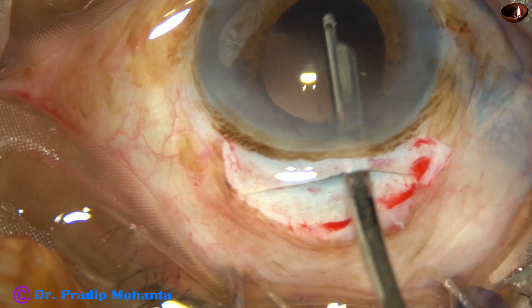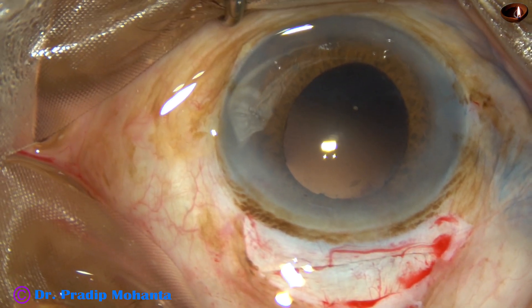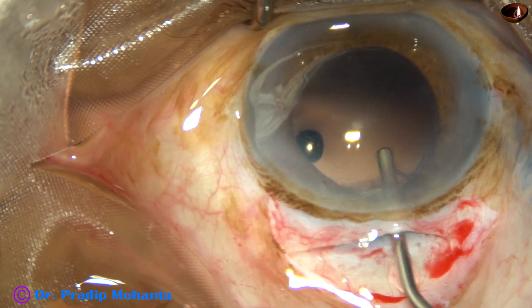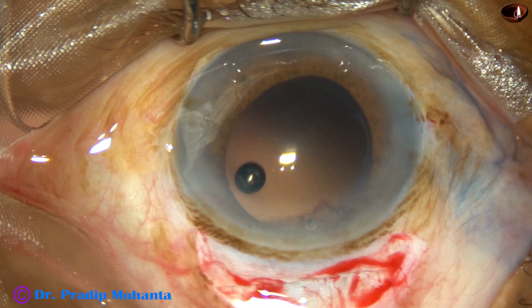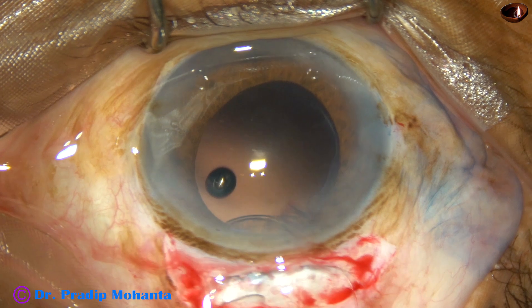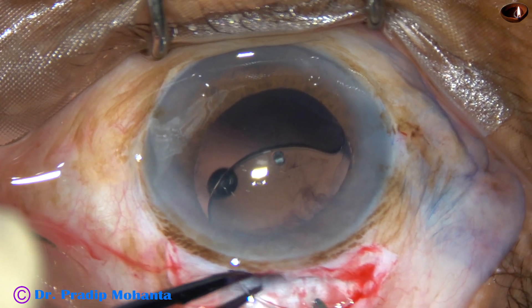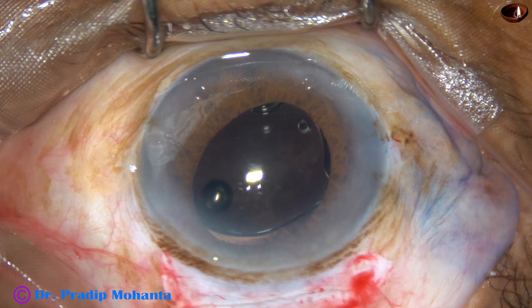Now the cortex has been nicely cleaned and an intraocular lens is to be implanted in the capsular bag. This is HPMC filling the anterior chamber and the capsular bag. A rigid PMMA intraocular lens is being placed in the capsular bag. With the help of McPherson's forceps, the trailing haptic is placed in the capsular bag.